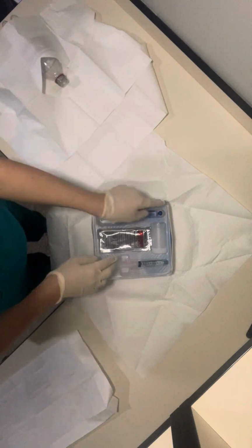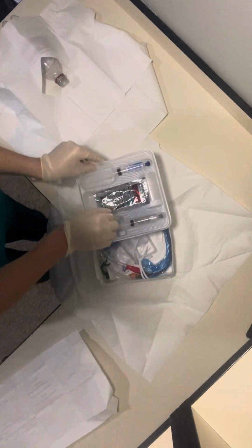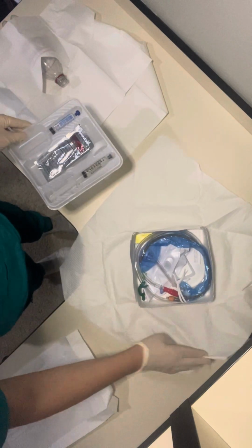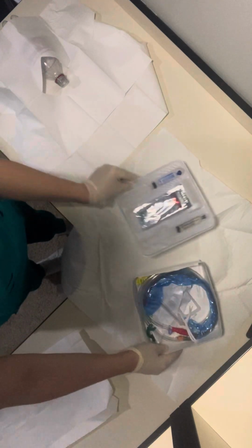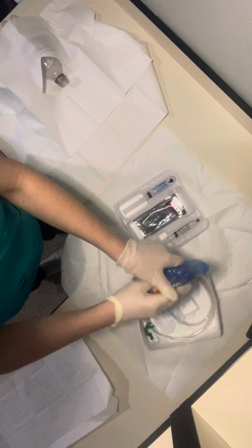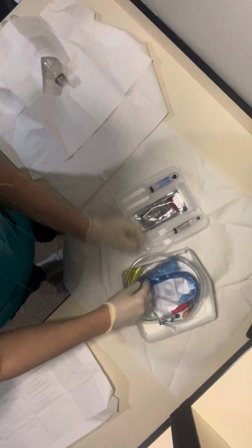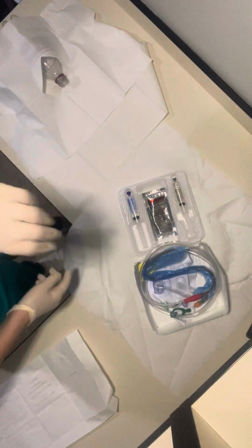Okay, so now I'm just going to prepare my kit. And so it's kind of touching some areas, and it would not, but normally if I had a bedside table, I would have more space. Okay. And so we get my bag ready. And so I'm going to face this way. So you would keep everything in the center of your field.